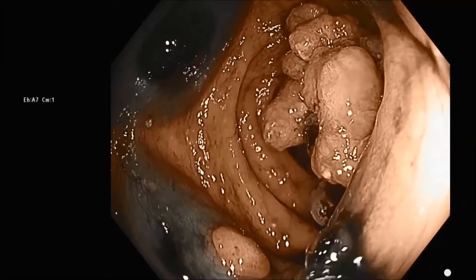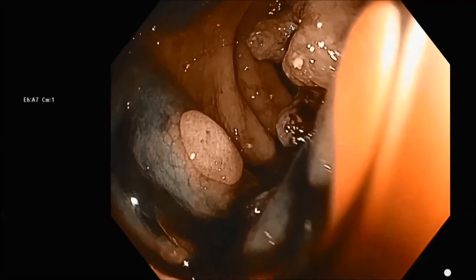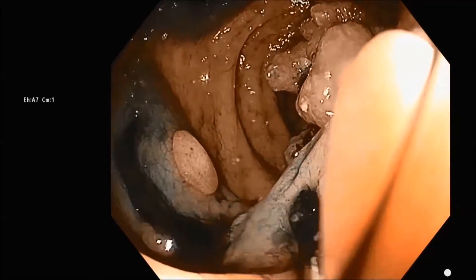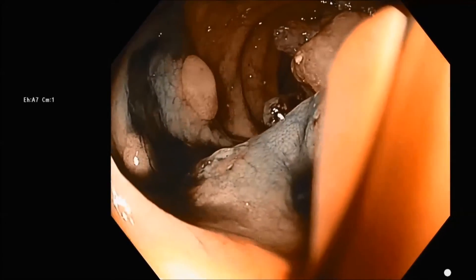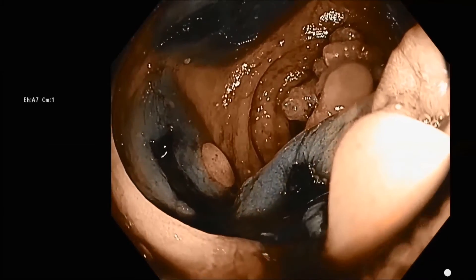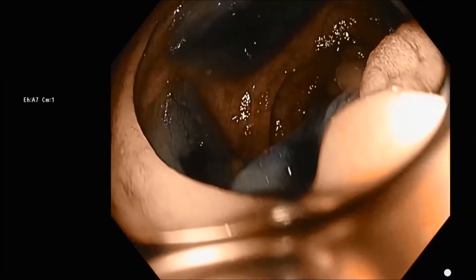It gives a nice demonstration of being able to see the blebs very easily. You can see how we're continuing to move around four quadrants, and the advantage of this for surgery is that one of these is going to be visible on the anti-mesenteric side of the colon for the surgeon to easily see the location.